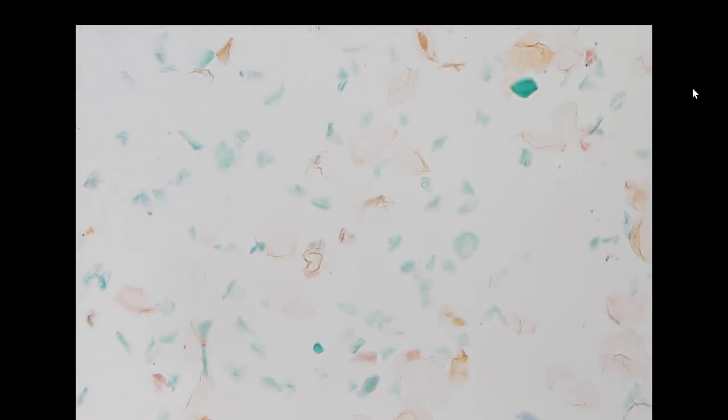Usually for the branchial cleft cyst, we will sometimes see more inflammation, and not only the squamous cells, because most of the time you will have respiratory epithelium and some mucinous material, but in this cystic lesion, it is very, very clean, only these clean anucleated squamous cells.